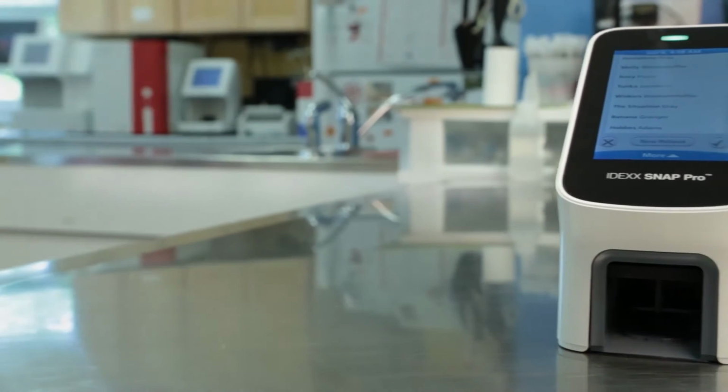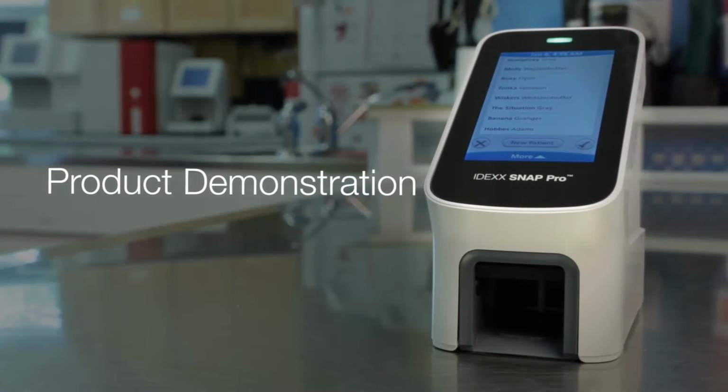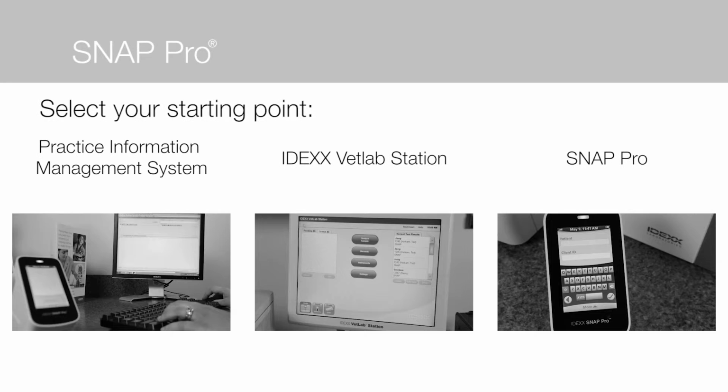This video will show you a quick demo for the Snap Pro, the new mobile device from IDEXX that is designed to enhance the workflow around Snap testing. There are 3 ways that you can begin your Snap run using the Snap Pro: by requesting your Snap test at the Practice Information Management System, by requesting your Snap test at the IDEXX Vet Lab Station, or by selecting New Patient on the Snap Pro.